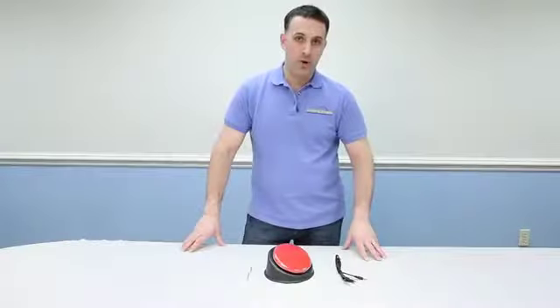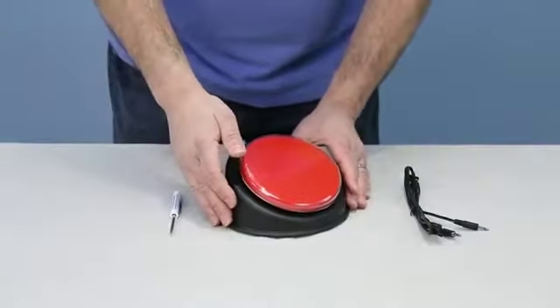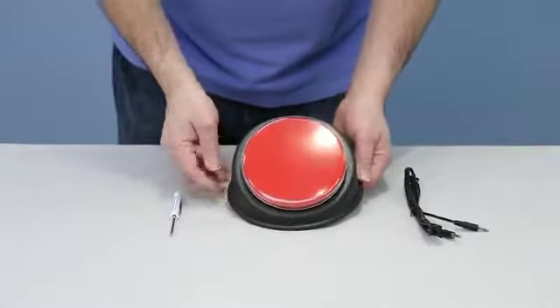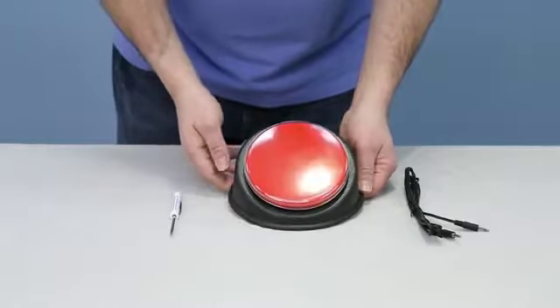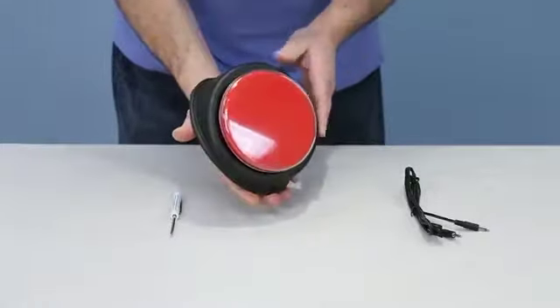Hi, Vinny Levote here, Tech Support Enabling Devices. Today I'd like to talk to you about one of our popular products, the Atom 4200 series Big Talk. This is one of our single message communicators, and it comes in five different colors: red, blue, green, yellow, and purple. I'm going to show you how to make a recording and then go over all the details.